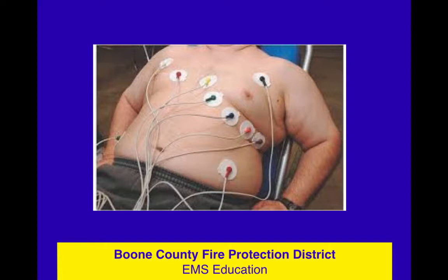This is a more typical patient than you see in some diagrams. You can see how the limb leads have worked their way up onto the chest — that left arm and right arm limb lead placement is a little closer than ideal. I'd rather those be more up on the limbs. The red wire for left leg and the green wire for the right leg — that position is okay. I just like those upper two arm leads to be closer to the arms than the chest. But it gives you a good idea where V1, V2, V3, V4, V5, and V6 should go on the chest.